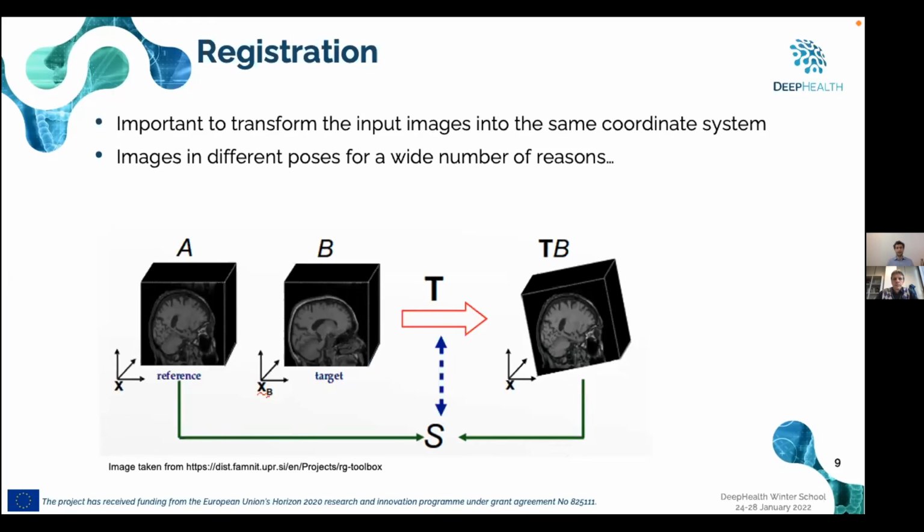If we expect to find the brain always in the same pose, we know where a given vessel, for example, is going to be, roughly. And we're going to get consistently more robust towards head movement by the patient, which are just physiological. And so registration is a typical practice for image processing, especially for this kind of task.